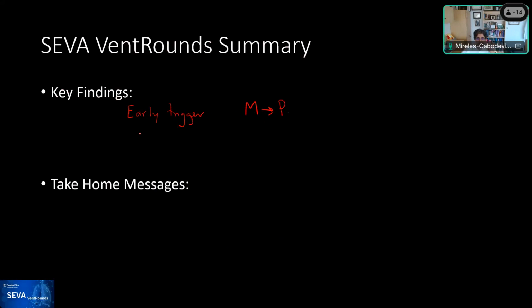The second one is that what the ventilators call dynamic compliance can look normal or beautiful. It can look great, right? You will see it and you would be excited about what you're seeing. In this case, 89.